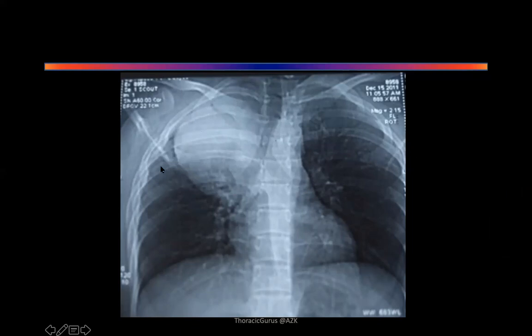Differential diagnosis. Nicely lobulated tumor, potentially not invading the chest wall, situated at the apex of the right lung. Pancoast tumor. And pulling the trachea to the side. Is this coming from the lung? Is it coming from the chest wall or is it coming from the mediastinum? Coming from the lung. Mediastinum. It's pulling, man. Nikhil, it's pulling. So it's coming more likely from the mediastinum. The spillover to this side is only incidental because of the location, but it's more likely coming from the mediastinum. You understand? This is how you analyze it.